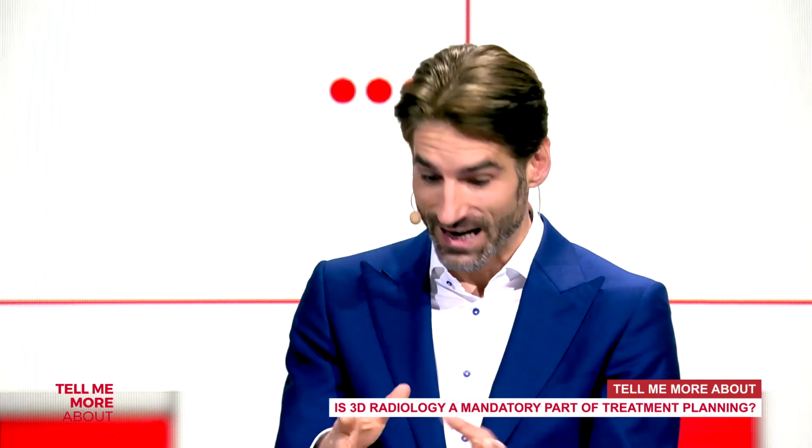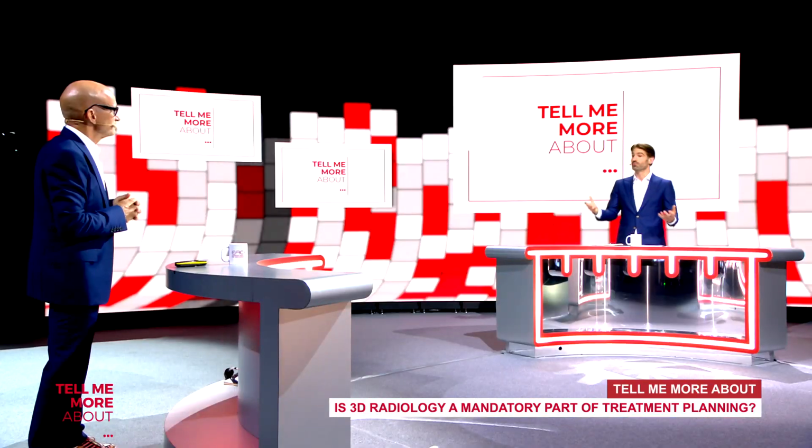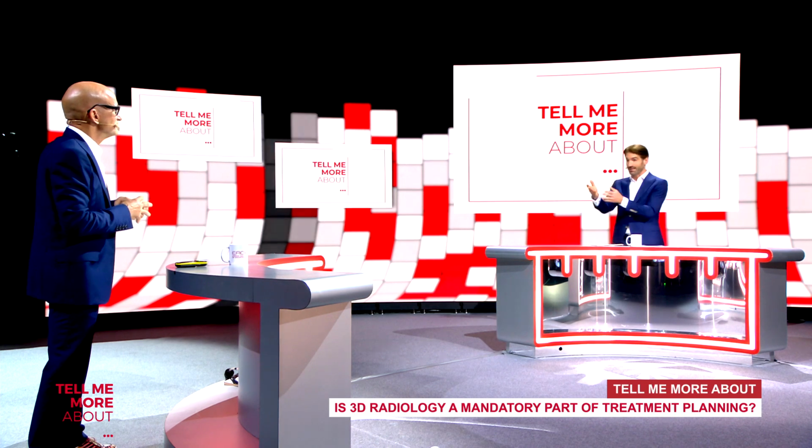Yeah, and even with the offline navigation, your eyes are where your hands are, right? In the static one, you are there, like normal. Yeah. That's why, in my opinion, it's a little bit easier to use. With the dynamic, you stay there, and you really have to trust the computer. Exactly. And that's an important point. We talk in this conference a lot about digital workflows, from diagnostics to planning to now also even surgery. Let's talk a little bit about accuracy.